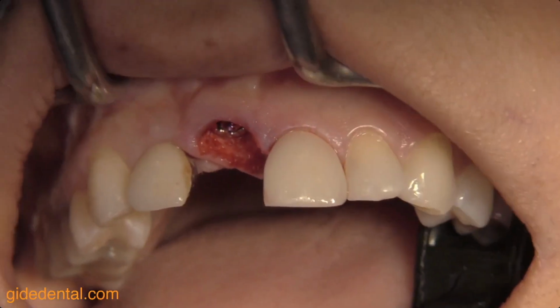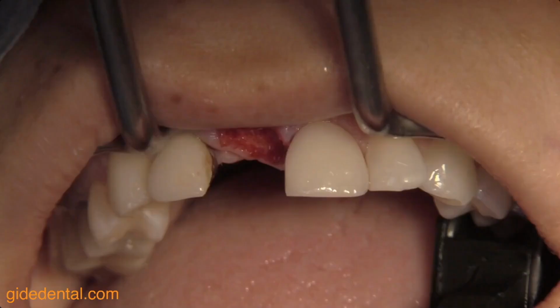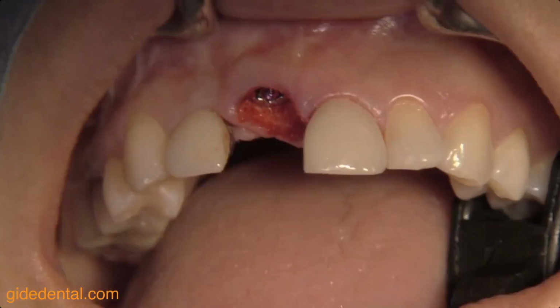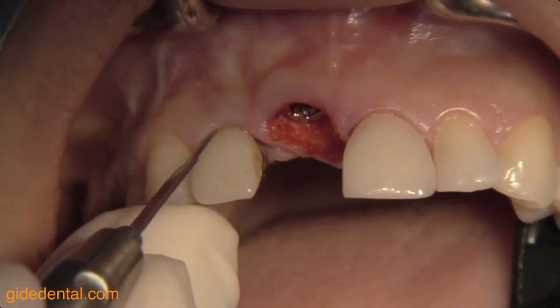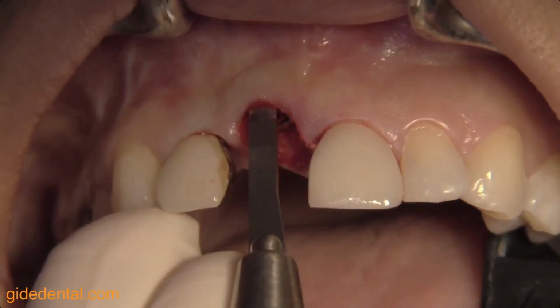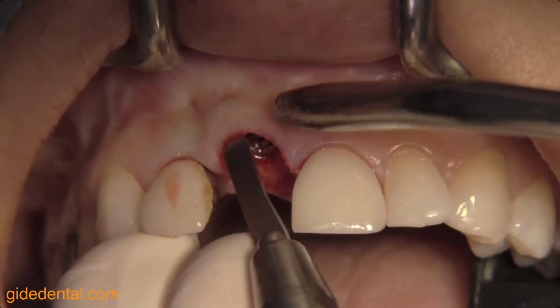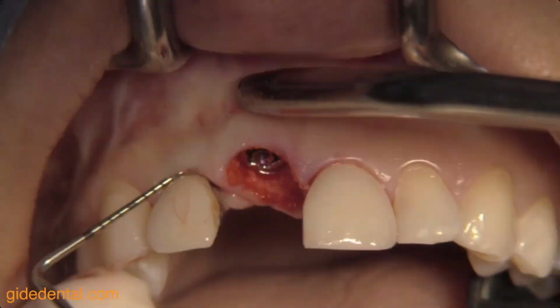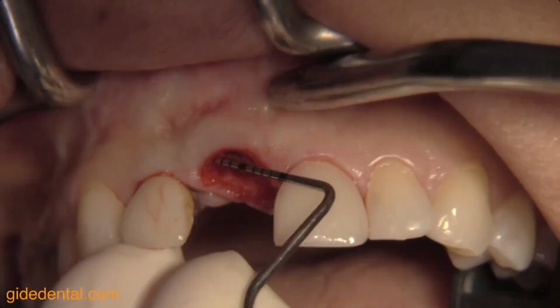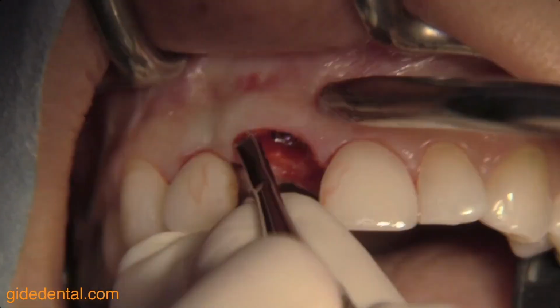Now the next step is, so we have placed the implant, we have placed the biomaterial, the BioOS, and we have placed the base abutment. So next step will be that I'm going to make a tunnel procedure using a microsurgical blade, leaving the papilla intact to receive an autologous, so a patient's own connective tissue graft, to thicken the buccal gingival margin on the tooth that we just removed, so on the new implant side.